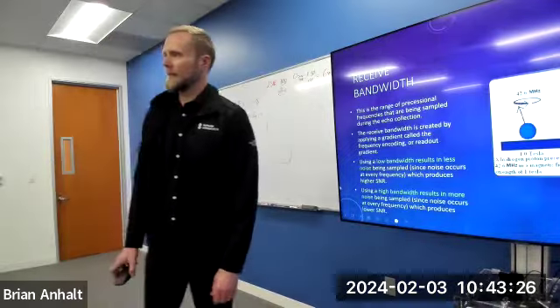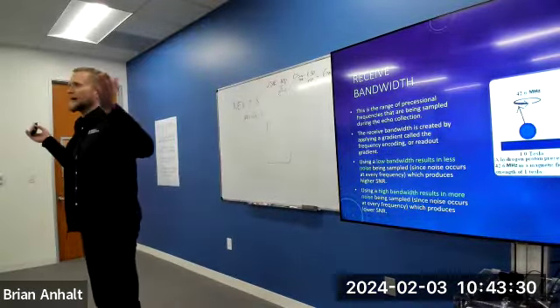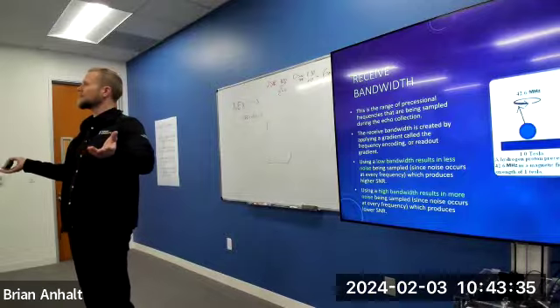So how does this relate in MRI? Why would we have a range of frequencies? We know we have the precessional frequency of hydrogen when we excite, right? So why would there be a range? That's just one frequency.